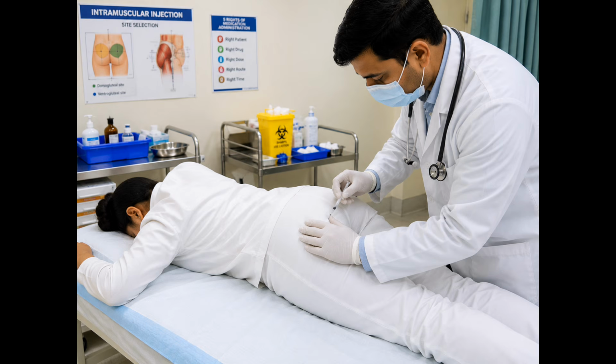Every IM injection begins with careful preparation. Before administering any medication, the healthcare professional reviews the physician's prescription and verifies the patient's identity using approved identification methods. The medication name, dosage, expiration date, and prescribed route are carefully checked. Patient allergies and medical history are also reviewed to help prevent medication errors and adverse reactions.